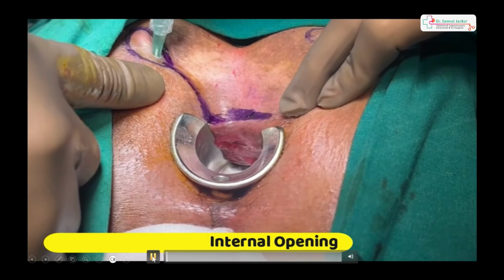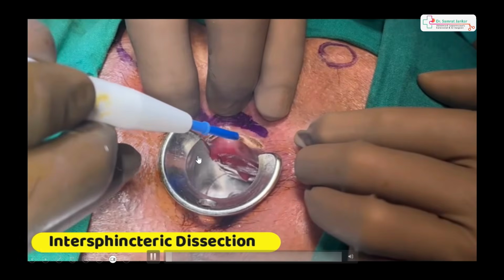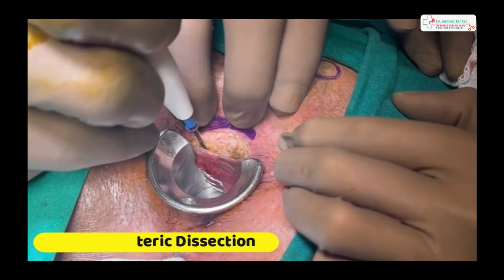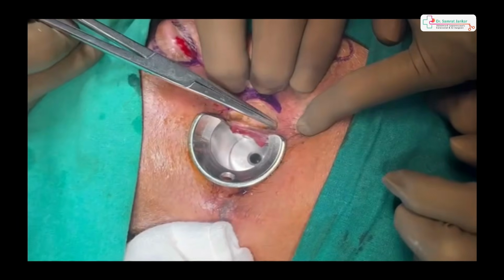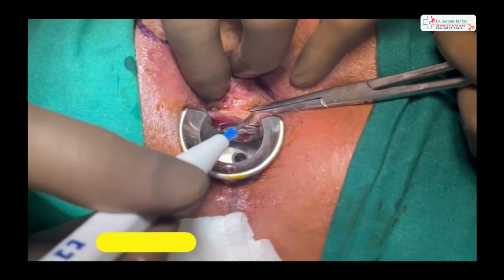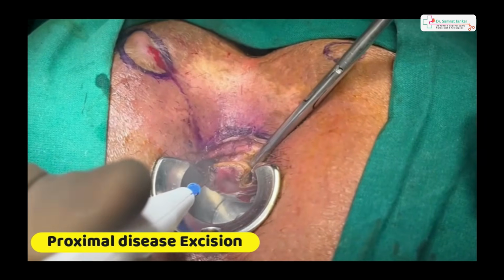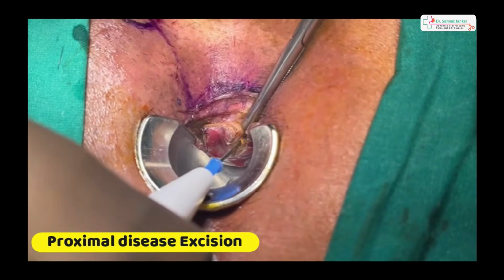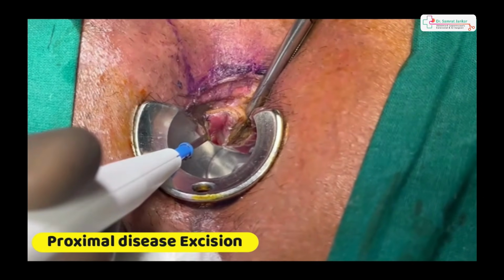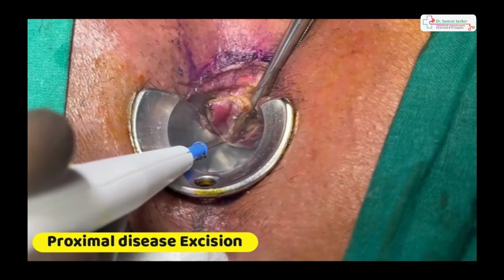For the patient in prone position, we identify the internal opening first, and we go to the intersphincteric space as we do in the LIFT. Then we isolate the tract on both sides by using the instrument. Once we isolate, rather than ligating in the intersphincteric space, we excise the central disease, that is the proximal disease excision, the P of the PILTEC procedure. And then once we excise the proximal disease, that is the central disease excision, we go for intersphincteric clearance.